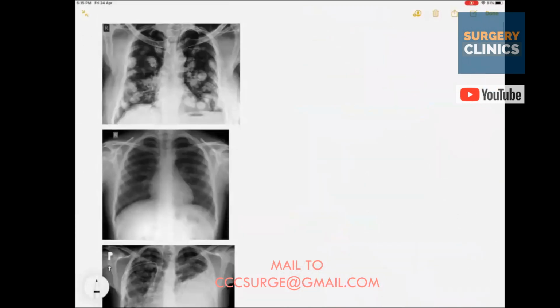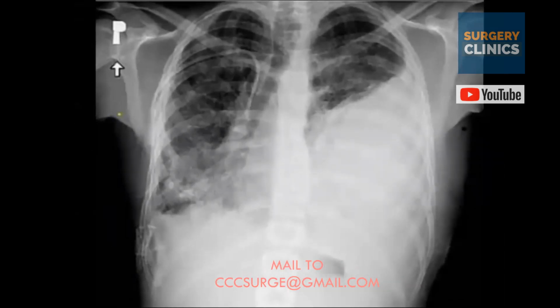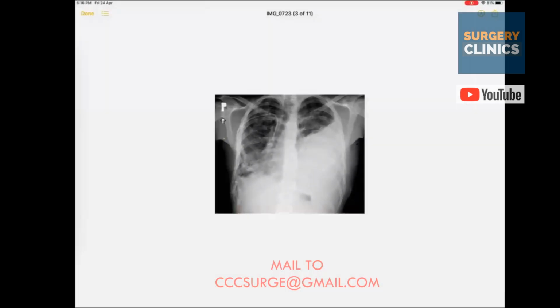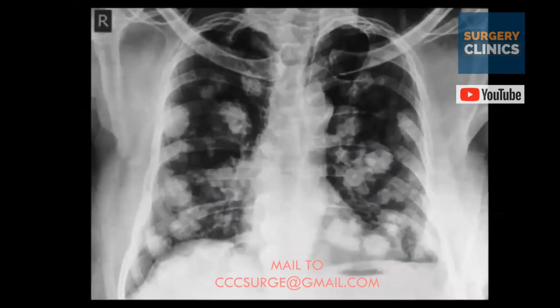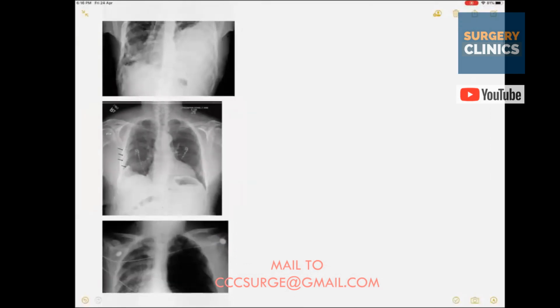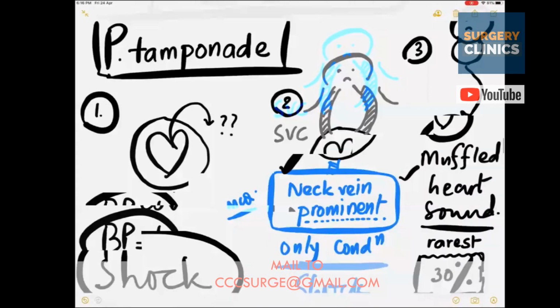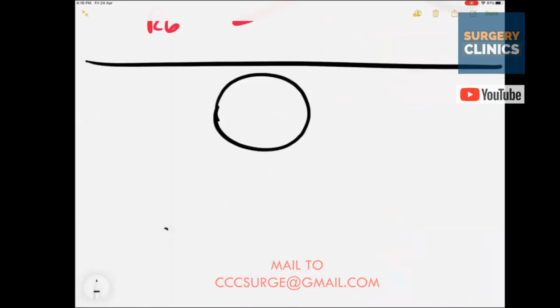So I've told you more or less all things today about this one. This is something that I taught you in the beginning, blood or liquid, as you may say, in the pleural cavity. To end the class, I will now go to another arena, not accidents, not trauma, but a patient with a kidney lump.